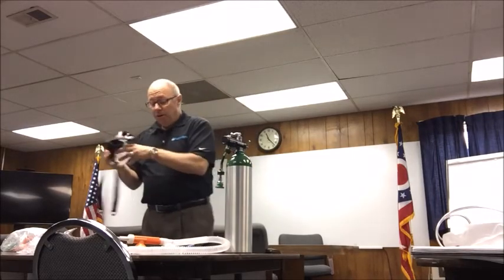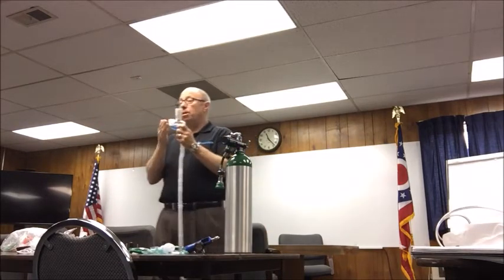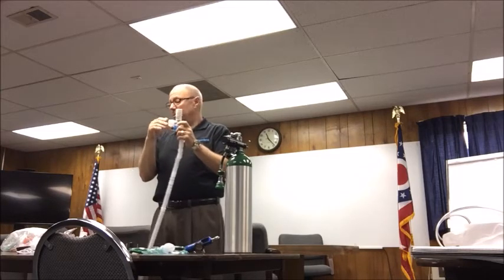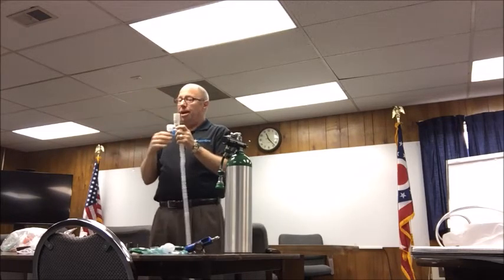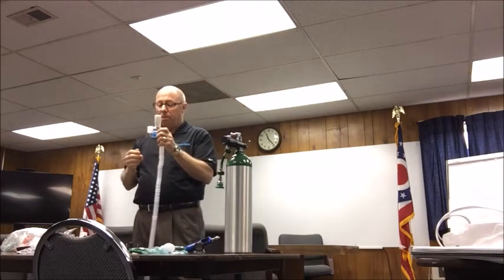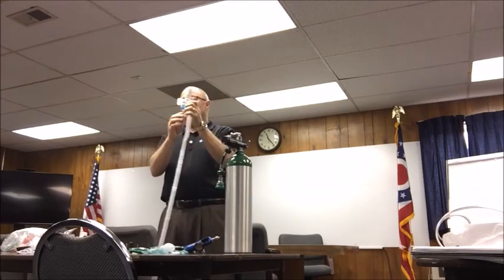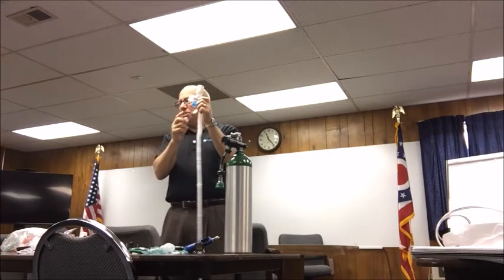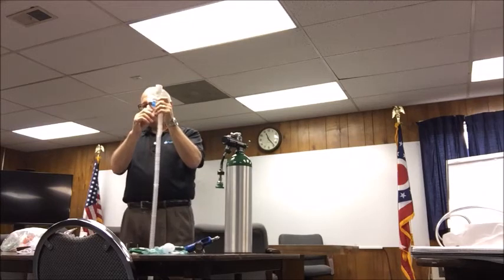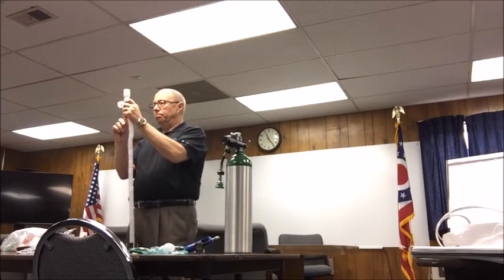So I went to the president and I said, I'd like to incorporate our T-tube or our port into the circuit. Drew it out and literally took it to the engineers, had it on the CAD drawing. We actually had it built the next day on our 3D printer, plastic printer. Our T-tube is different than any one out. Well, there's one other out there, but this has a check valve in it. This is still a closed system. This is nothing more than a dust cover. So when I insert the canister, the check valve goes up, it goes down.